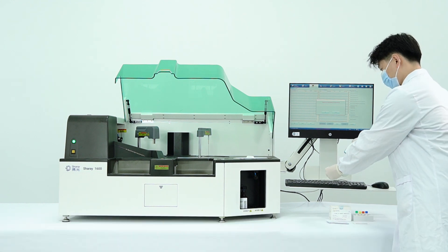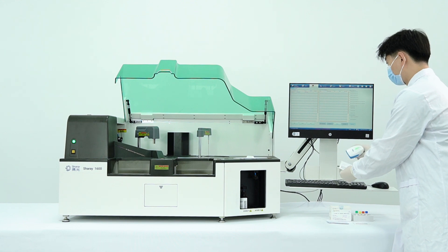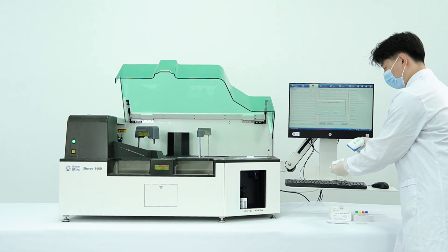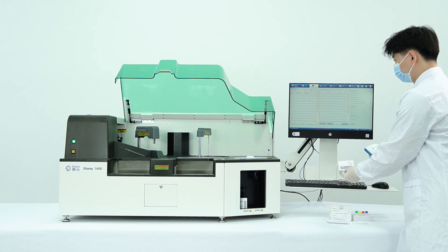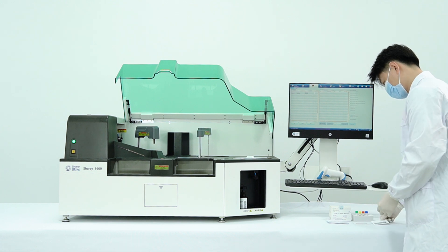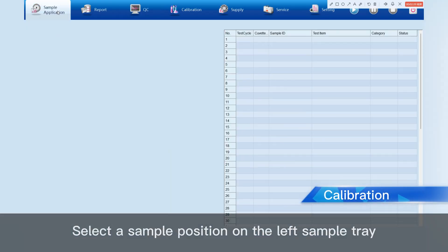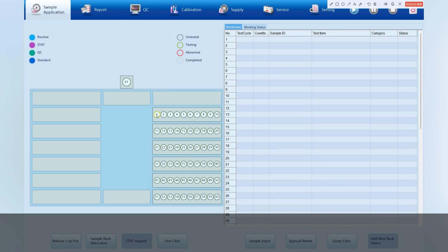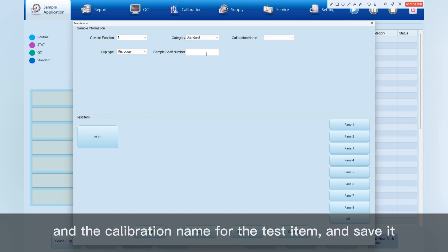Scan the QC code. Select the sample position on the left sample tray and click the Sample Input button. Select the standard option and the calibration name for the test item, and save it.